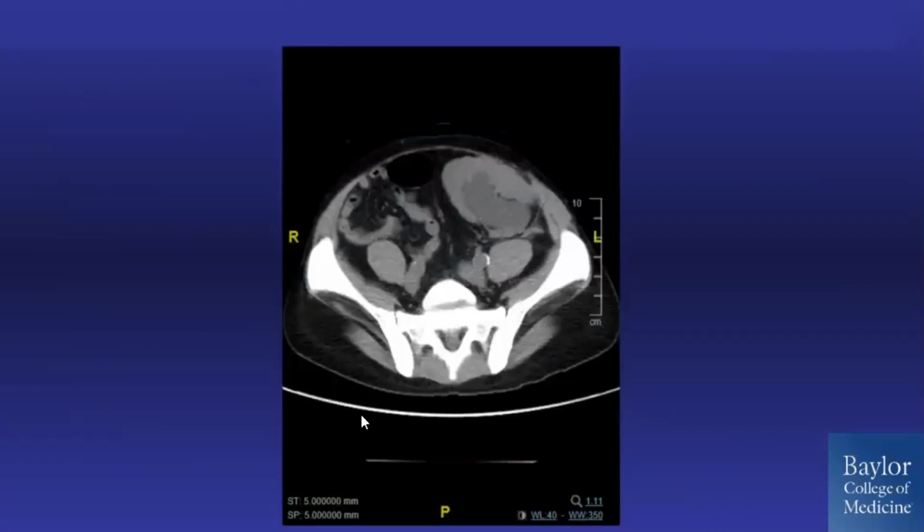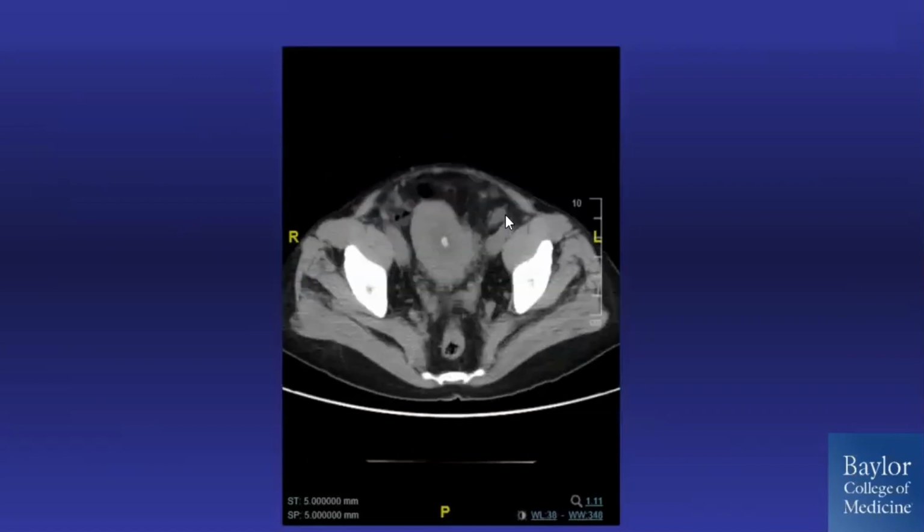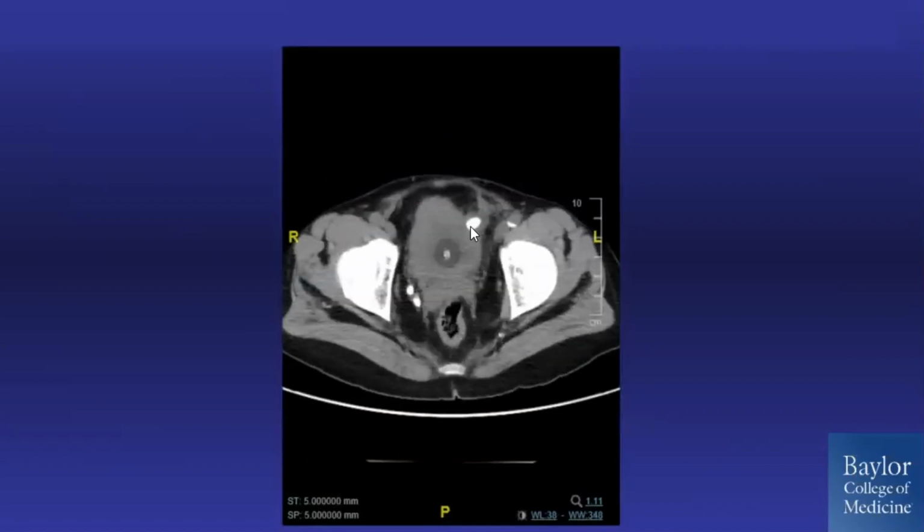So this is a transplant allograft in the left lower quadrant with some hydro. And you can watch the hydro ureter down to the level of a pretty good-sized stone in a patient I was called about a few years ago.